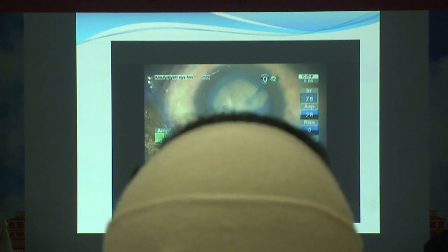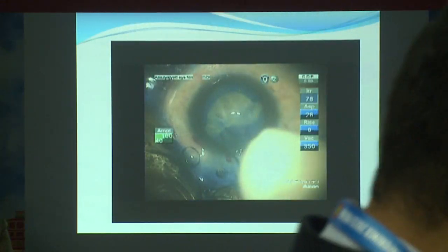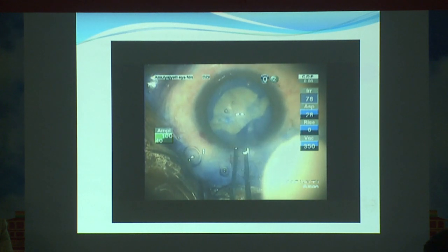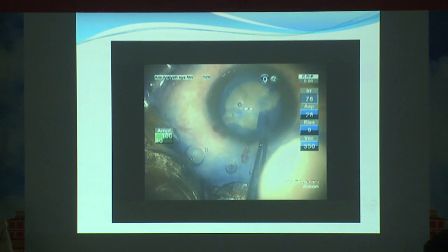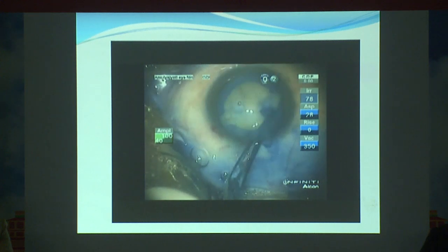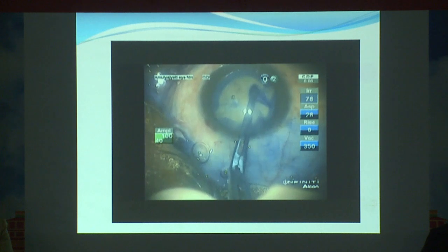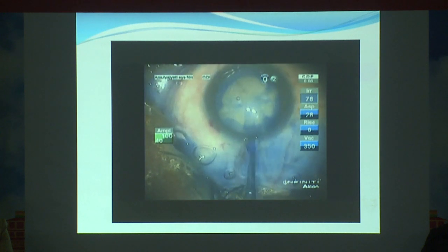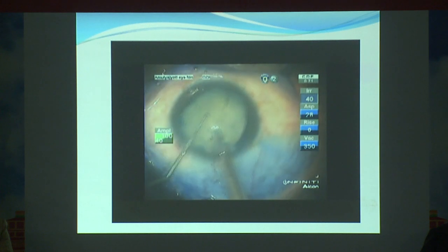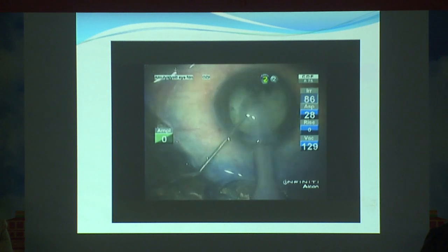Fortunately, these types of cataracts are quite easy to chop. So in most of the cases, if not all, you can go ahead and do the phaco and complete the phaco. But again, the principle has to be followed. You have to make sure it's not extending by looking at the flap sign. Do slow phaco, and if you have a 3-piece lens, give it in the sulcus. Otherwise, the option is giving a single-piece lens on the preserved hemirhexis. Thank you so much for your patience in hearing.